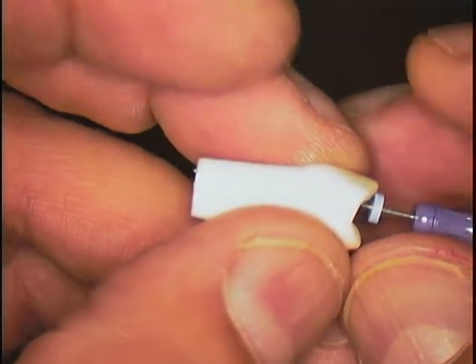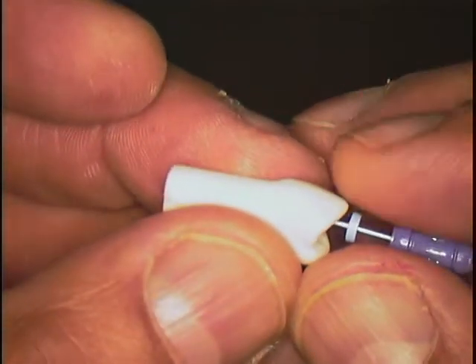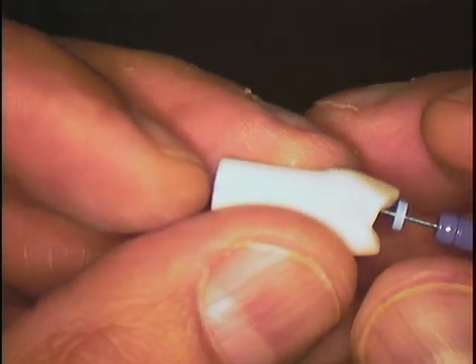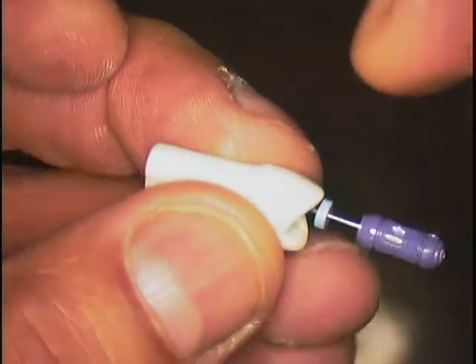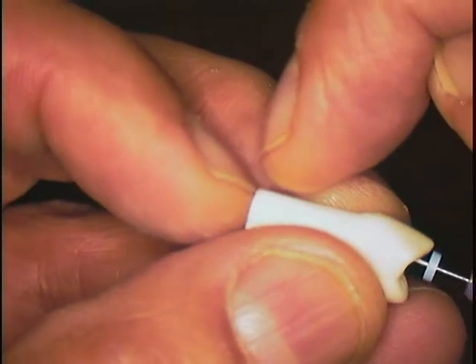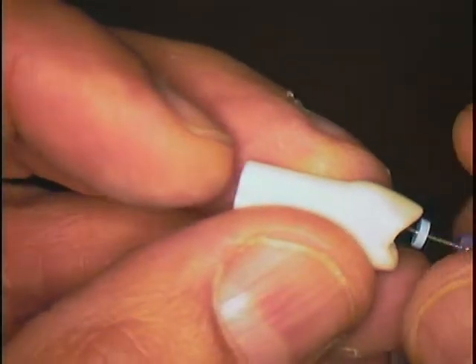Okay, so here's your first measure, and it's the most important one that you can measure. You want to get the working length. So the total length of the tooth from the buccal cusp to the end here minus a half a millimeter or quarter millimeter to a half a millimeter is going to be your working length. So we're going to create an apical constriction by measuring the total length. So let's do that.